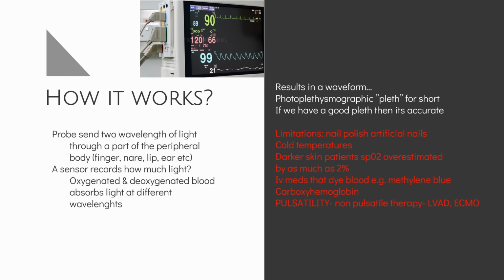There are big limitations on saturation monitoring, and here are some of them. Nail polish and artificial nails will affect this monitoring of the waveforms of light. That is why it's part of our pre-op care that those are removed before a patient has saturation monitoring in theatre, and the same goes for ICU. I'm sure we've all been in a situation where you have a patient with cold fingers and the saturation just won't work, and we're wrapping them up in a towel trying to warm them up. Cold temperatures definitely affect that pulsatile wave.